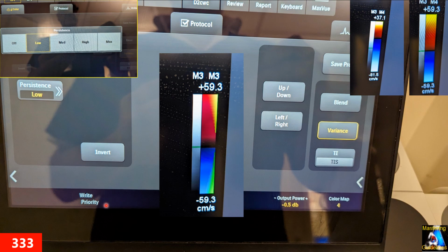And this option in echo, we don't use too much because usually we have big vessels and a big area of blood flow. But in vascular, especially small parts like the testis, the thyroid, and all those structures that have very small vessels, and we have flash artifact, or where we have a cyst and the blood flow fills the inside of the cyst due to flash artifact, we can change the write priority, show blood flow and differentiate blood flow from the non-flow.